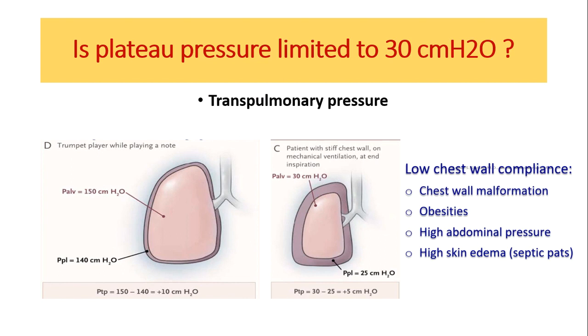The second question which you want to know, everybody says plateau pressure 30, plateau pressure 30. Why this plateau pressure 30? Is plateau pressure 30 the target value?